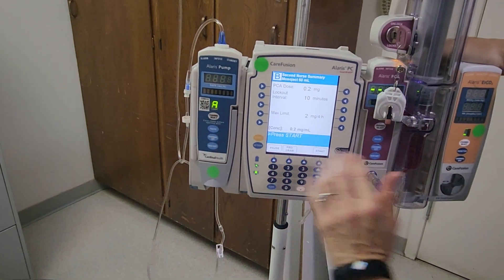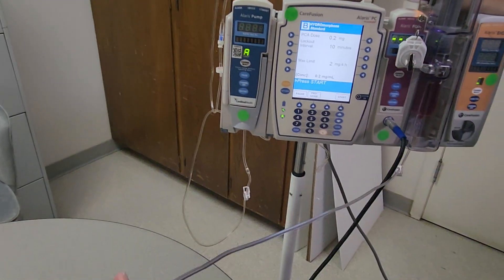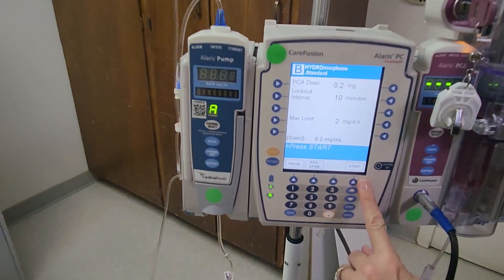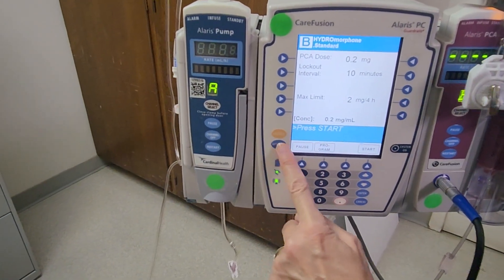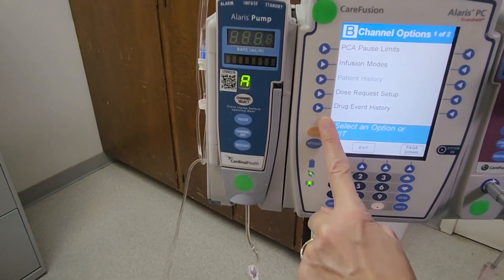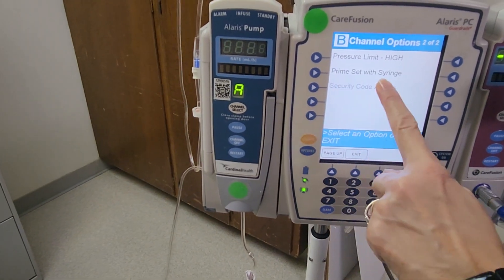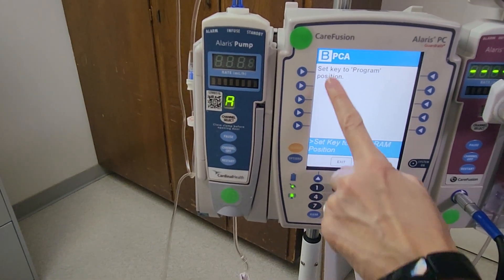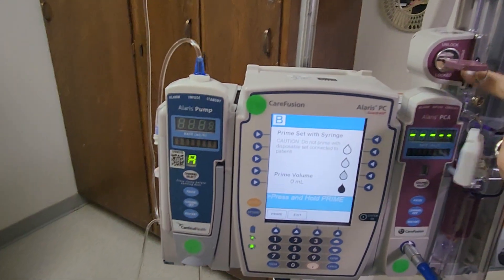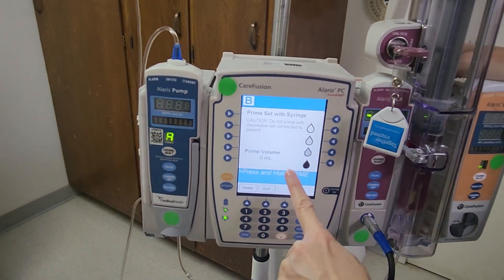It's telling me to press start, but we have not primed our tubing yet, so we need to do that — we prime our tubing on the pump. Instead of hitting start, go under options and page down to find 'Prime set with syringe.' Set the key to the program position, and it tells you to prime the set with the syringe. Do not prime with the disposable set connected to the patient, so we don't want to give them any air or a medication bolus.